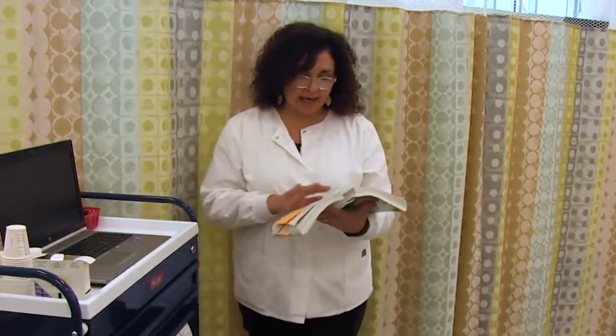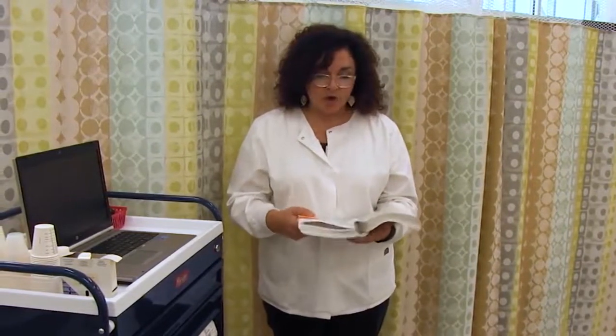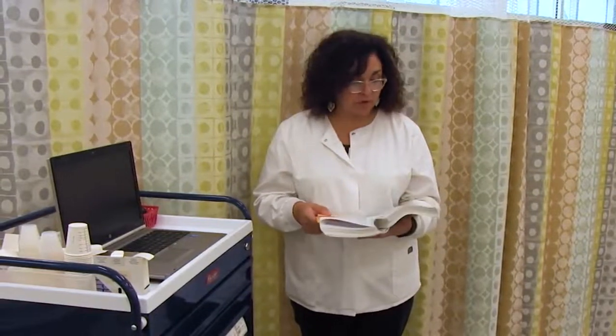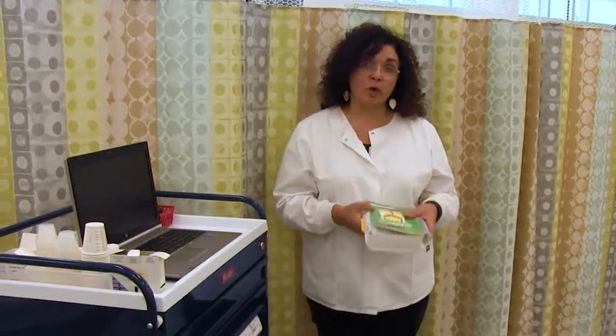And then T, time. So I look for the administration time, and it tells me a single dose over a minimum of 15 seconds, evenly distributed over 1 to 2 minutes is preferred. So for Toradol, yes, it is appropriate for the IV push route. Yes, it is compatible with my primary fluids, and I need to give it over no less than 15 seconds, evenly distributed over 1 to 2 minutes is preferred. In this instance, I'm going to go ahead and give it over 1 minute.